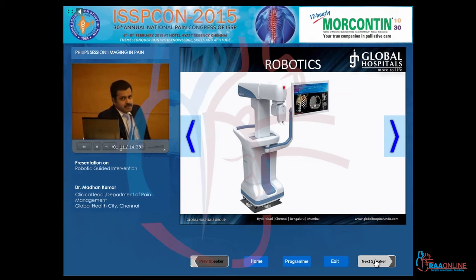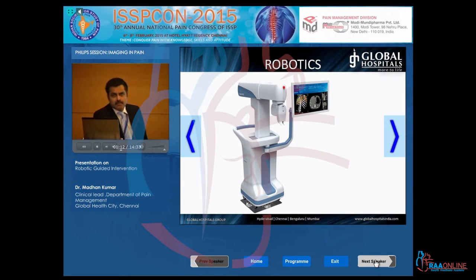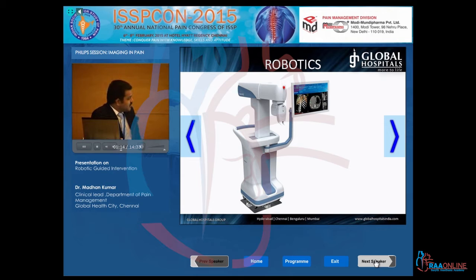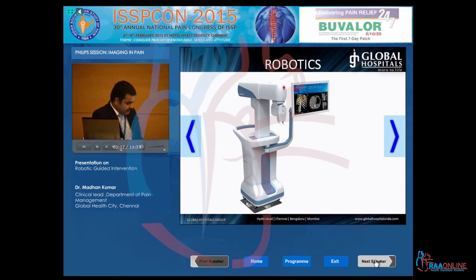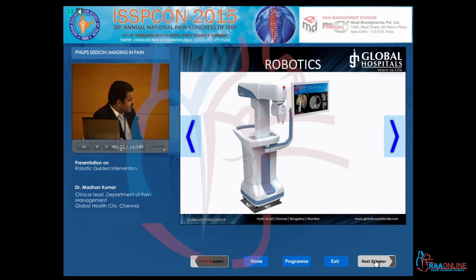This is the machine we use for robotic assistance. This machine comes with a CT, it comes with an inbuilt console, and this is a moving arm here.